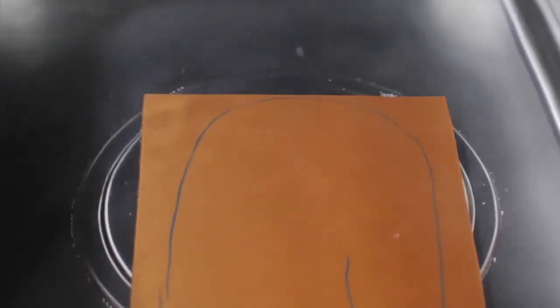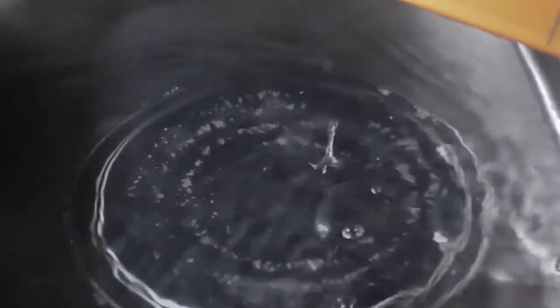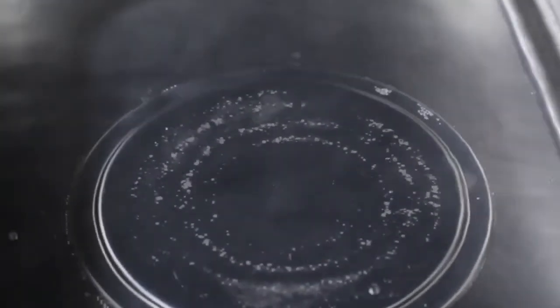Place the material briefly in the hot water to soften prior to cutting out the pattern. After cutting out the pattern, place the material back in the hot water to completely soften and activate.